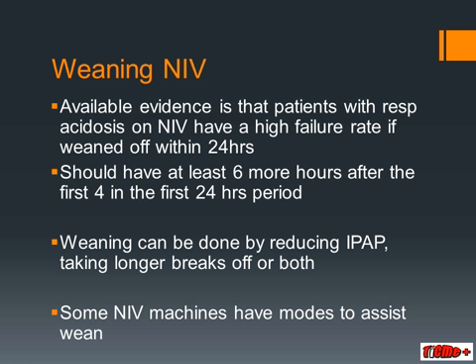Weaning can be done by reducing the IPAP values or taking longer breaks off the machine, and is usually a combination of both. Some of the more elaborate non-invasive ventilators have modes to assist the weaning process.